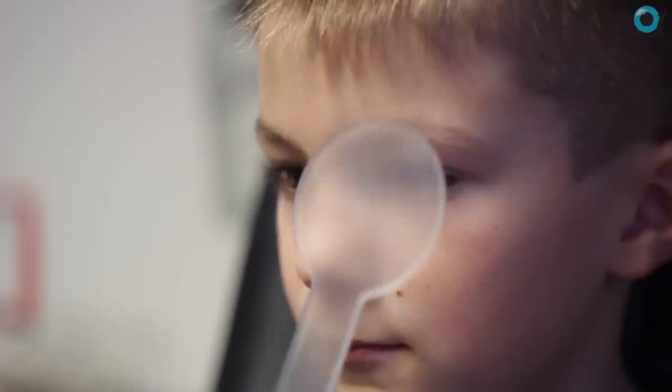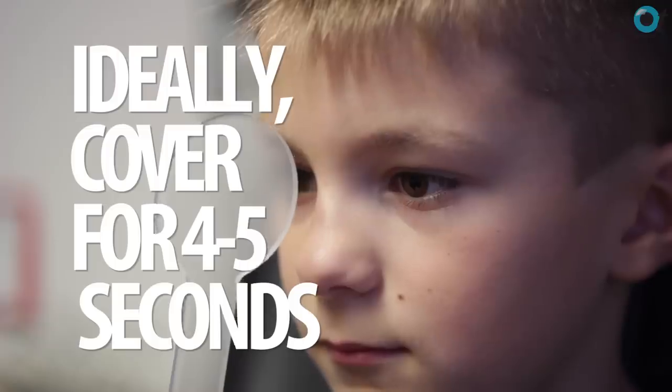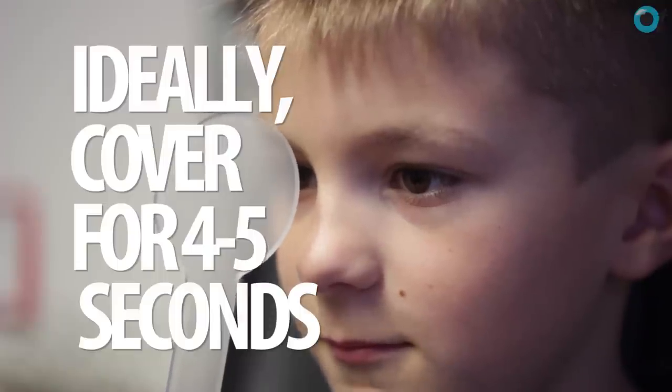How long should you keep the cover over the eye? Well, according to Professor Bruce Evans, at least two seconds is a good time. But Barnard, in his PhD thesis, did some experiments suggesting between four and five seconds would actually be significantly better. Don't forget that if you've got a patient who's an amblyope or who has significant hypermetropia but isn't wearing any correction, that patient will take much longer to click in their accommodation and to figure out where they need to look, so you need to leave a little bit more time for those patients.